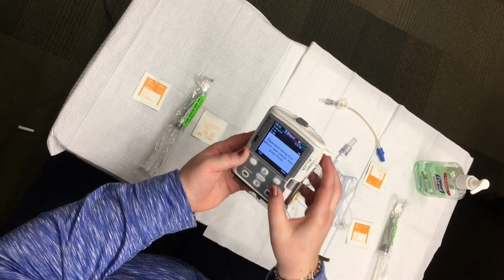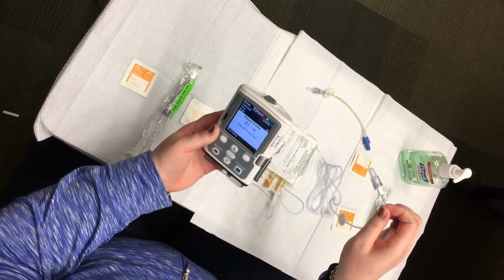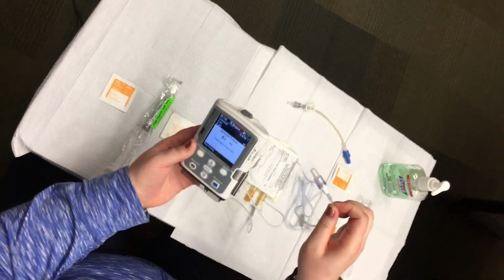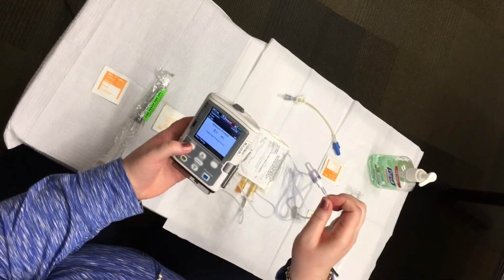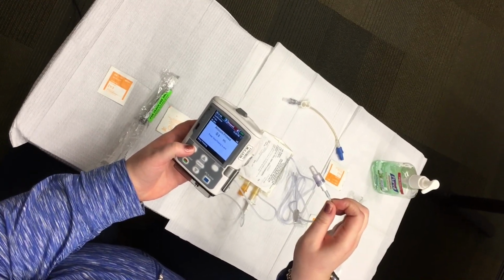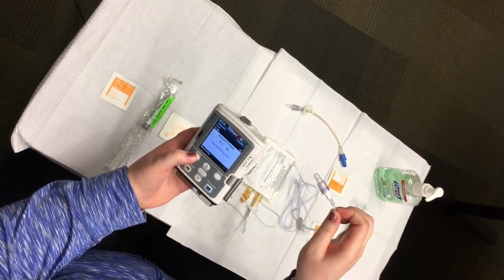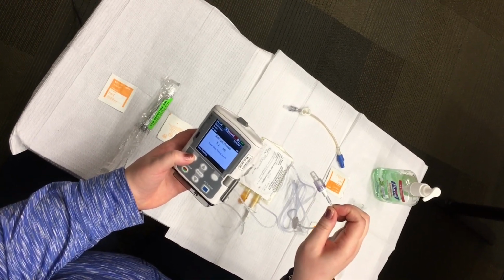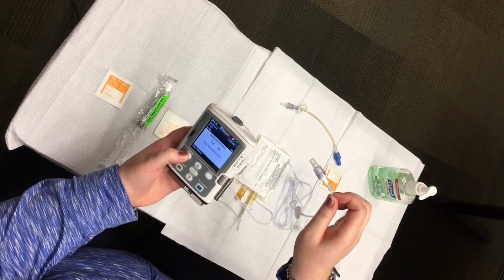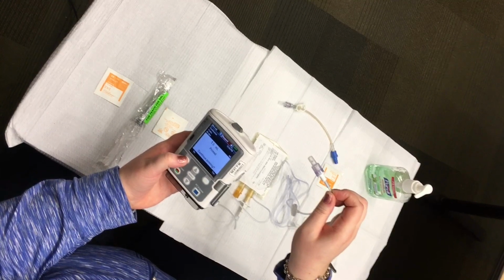Press the white button below the prime key. This will prime the tubing with fluid to get all the air out of the tubing prior to infusing the medication. Priming tubing times will vary depending on the type of tubing. When the fluid is at the end of the tubing, press the white button under stop priming.